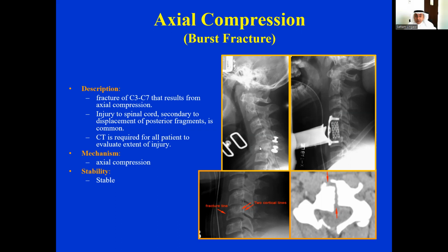Obviously, the treatment is by corpectomy, removal of the damaged vertebra, and placement of a titanium cage associated with fixation by plates and screws from the vertebra above to the vertebra below.